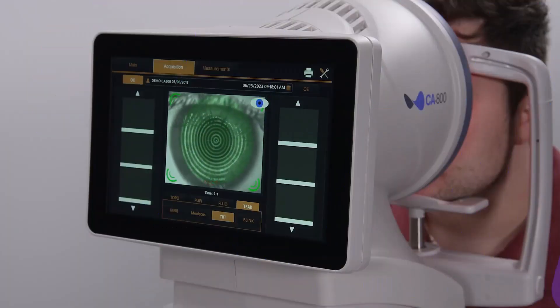Hi, I'm Candice, global trainer for TopCon Healthcare. In this video, we are going to capture the TBT on the CA800.